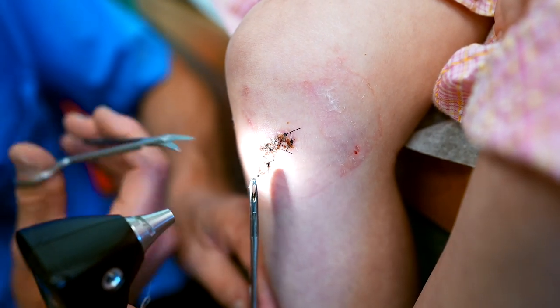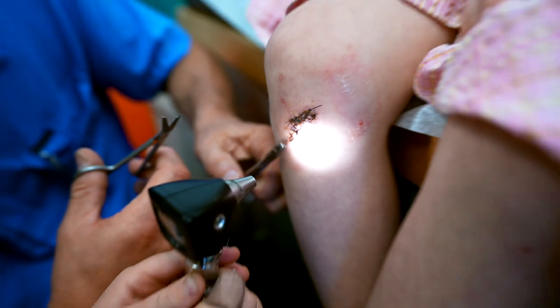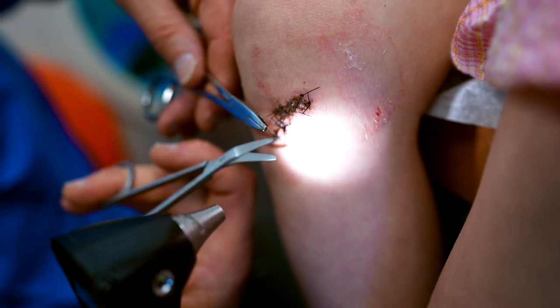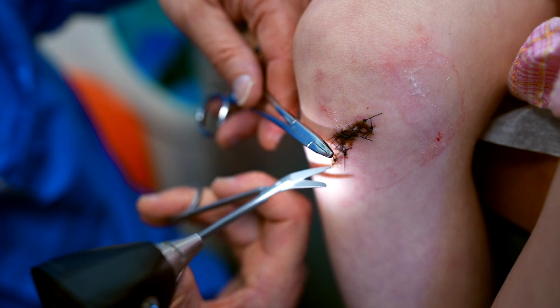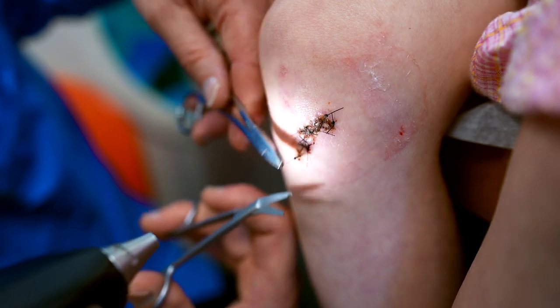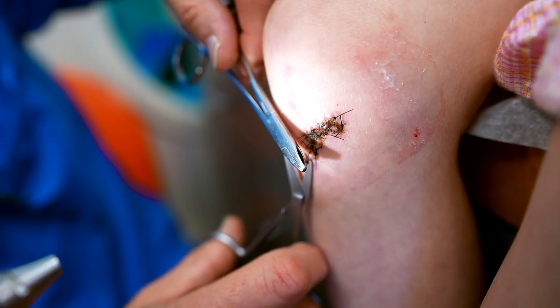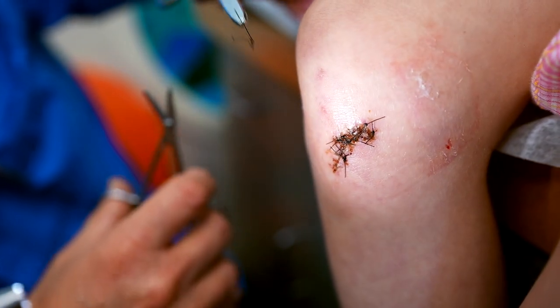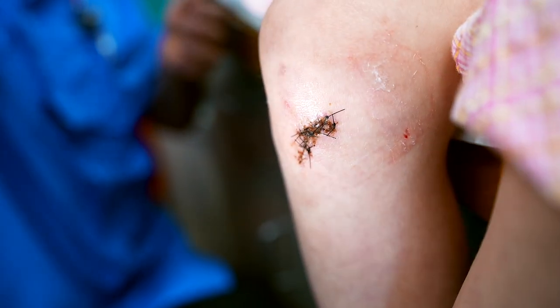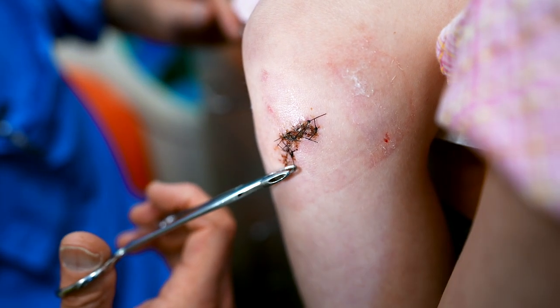And then I'll just get underneath it. Hold on. That hurt a little, I'm sorry. I think we got two for one somehow. You're so brave, you did great. I don't think the rest will be quite that hard. That one was just a little tricky.